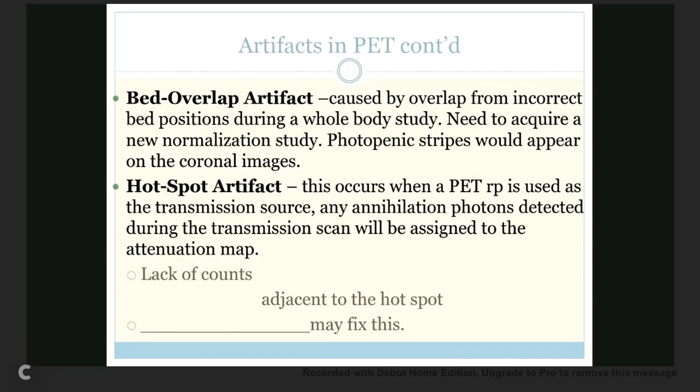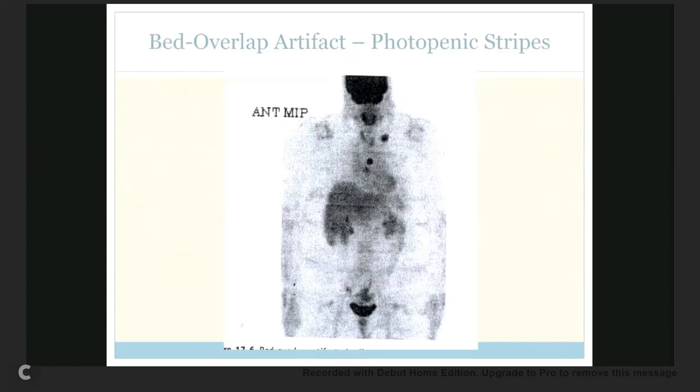Can you manipulate those filters on a PET? I don't know, we haven't gotten there yet. Well, you've never done PET, Robert? I don't recall doing anything with filters. Who's worked with PET so far? I didn't realize you did. You're right. I'm not saying you're wrong. You can manipulate your filters. You just have to know what filters you're manipulating.